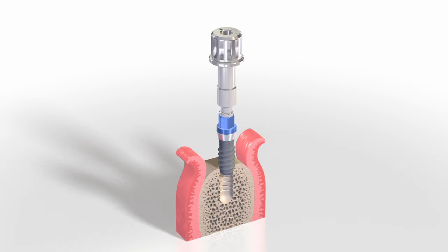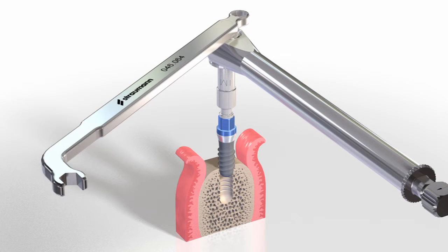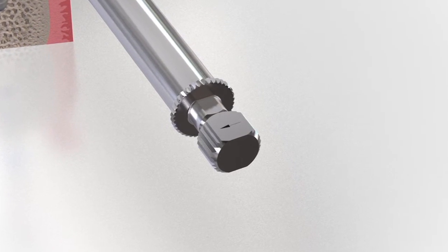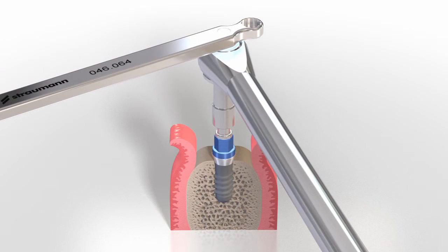The implant is placed manually into the implant bed with the aid of the adapter. One option for positioning the implant is to use the ratchet attached to the pivot of the holding key that functions as a stabilizer. The clockwise arrow on the knob indicates the direction of insertion. The implant is then brought into its final position by slowly manipulating the ratchet.